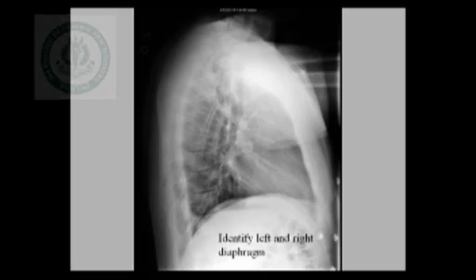So, now in a lateral view, interpretation depends upon which lateral it is. Normally, the side of pathology is kept closer to the film and you take a lateral view. Now, you should identify which lateral this is and which diaphragm comes where.